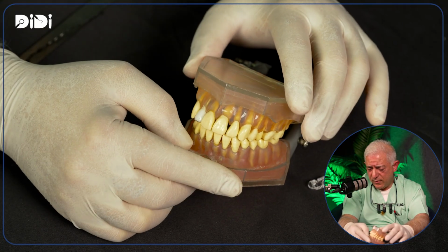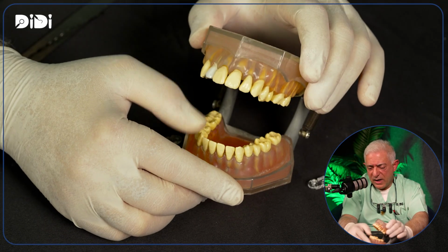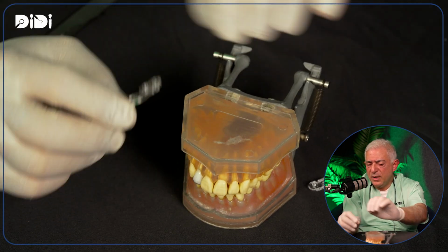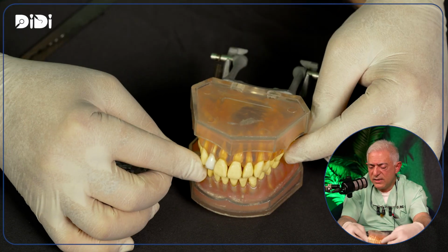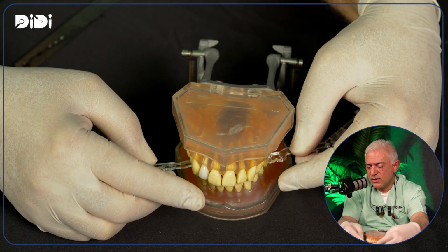We are not going to 5. We are going to 3 maximum and 1.5 minimum. We are not doing it less than 1.5 for any jaw, and we are not doing it more than 3 for both the jaws. So this 1.5 millimeter is an ideal instrument for all the cases where you want to increase the vertical dimension in one jaw, and the 3 millimeter for both the jaws.